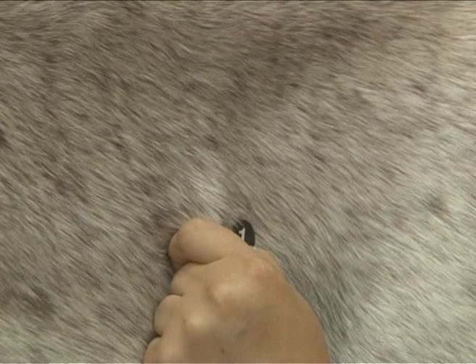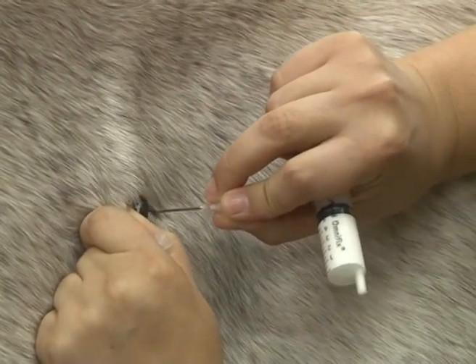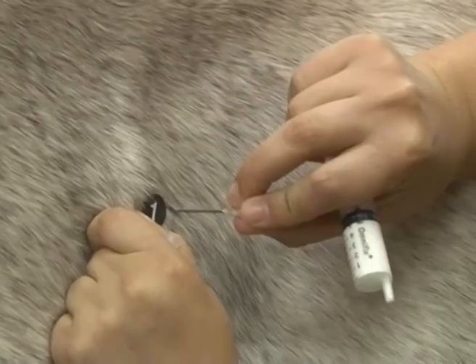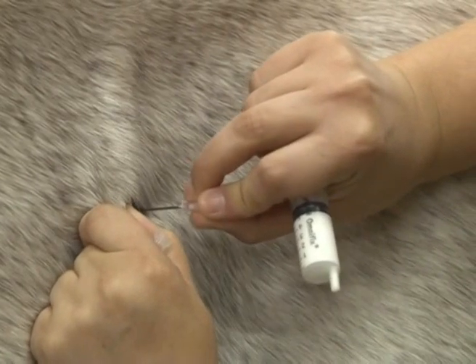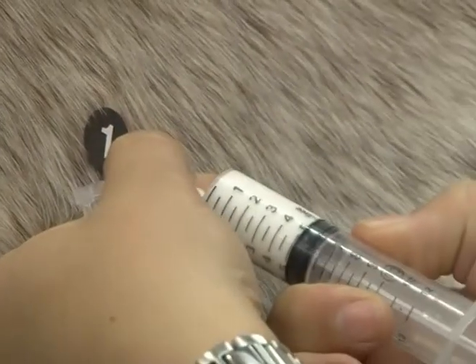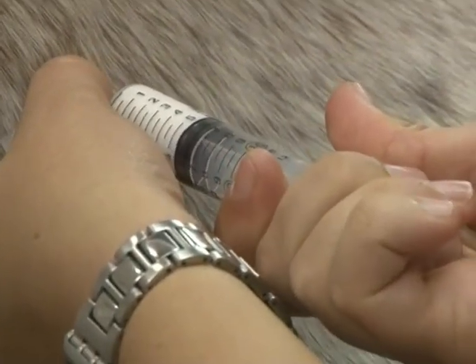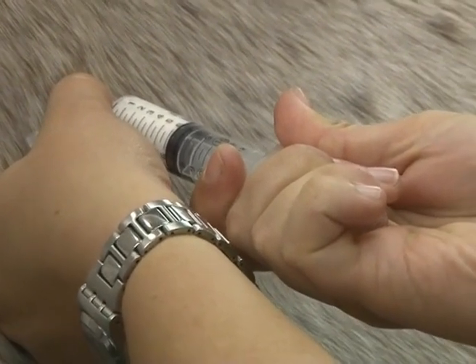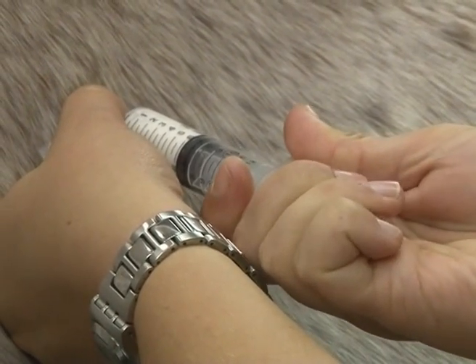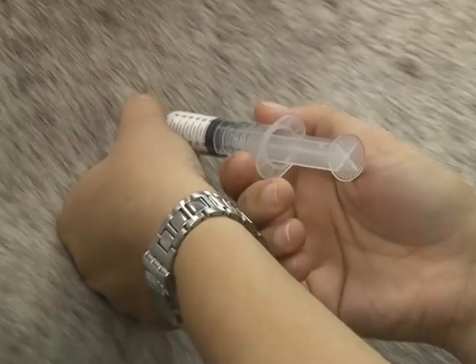Pinch a small fold of skin firmly between finger and thumb — the mini devil's grip — and slide the needle in next to the skin fold with the opposite hand. The needle should be pushed in to the hub. Once the needle is inserted, reconnect to the syringe and draw the plunger back before injecting to ascertain that the needle is not in a vessel. If there is any sign of blood, the needle must be redirected and the procedure repeated.